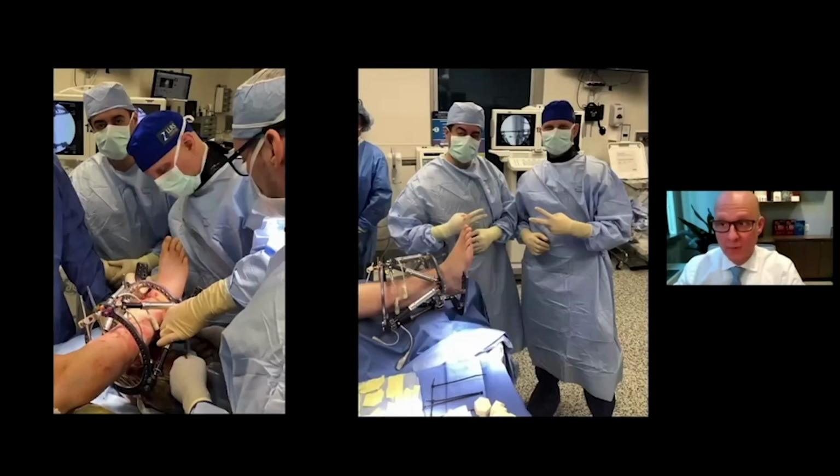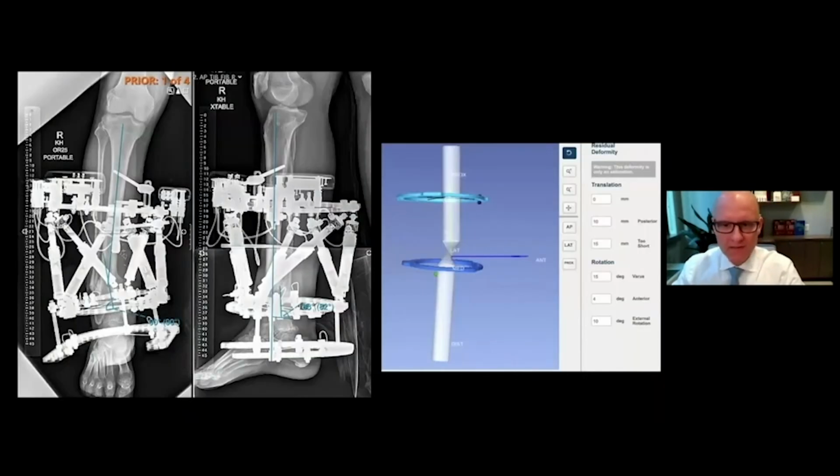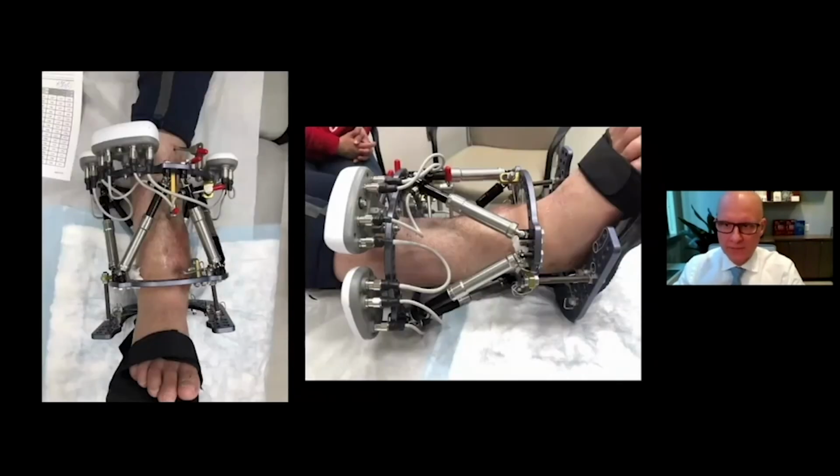So we're pushing the frame now. What can these struts do? Let's be sure they're just as strong as the other struts. I added a foot ring just for a little more stability because we're talking about a small distal piece of bone, truthfully. No half hinge, just wires in that little piece of bone. And so immediate post-op, upload the x-rays, do the program through MaxFrame system, and then hand it over to OrthoSpin team. They upload the program and then gradual adjustments.